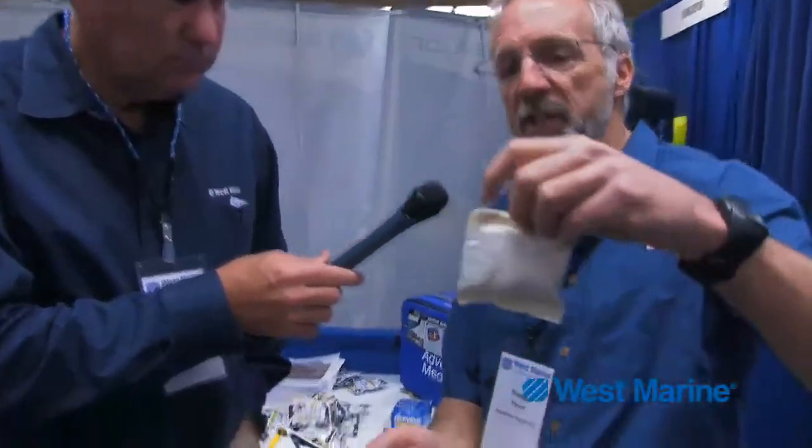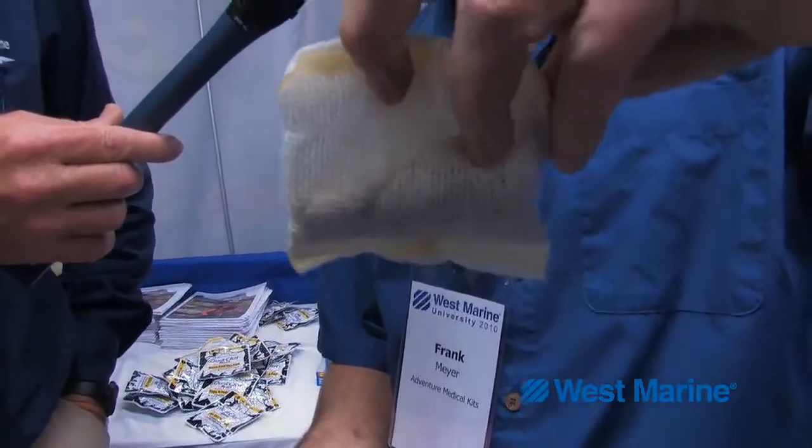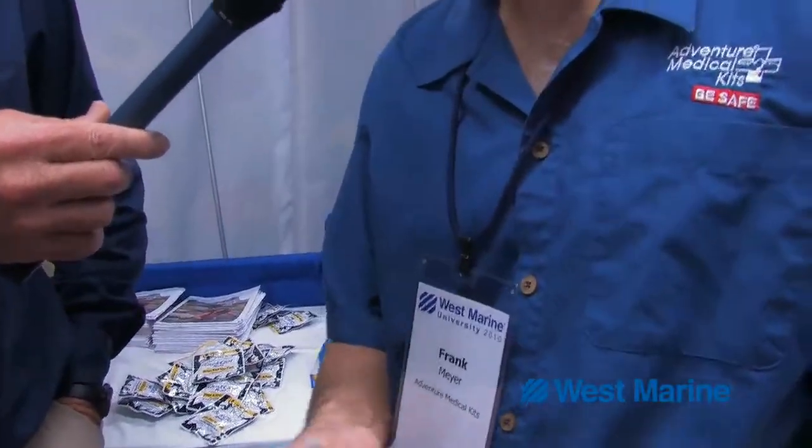There's a mesh pouch inside of this Quick Clot package. It's sterile. It contains zeolite mineral beads. Zeolite happens to pull water out of the air — it's a mineral that rapidly absorbs moisture. So when you put it inside of a bleeding wound, it pulls the water out of the blood, leaving the platelets behind to clot quickly.